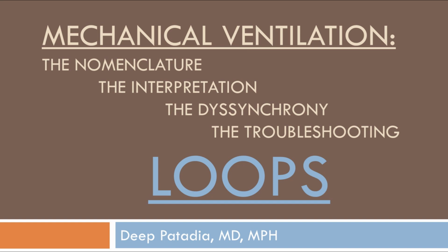Hey everyone, my name is DeepCrit, and with our next talk, we're going to talk about loops. I don't know why people fear loops, they get a little bit of anxiety, but loops can give you a lot of information about what's going on. So let's delve into loops.